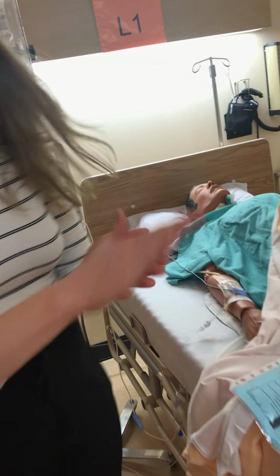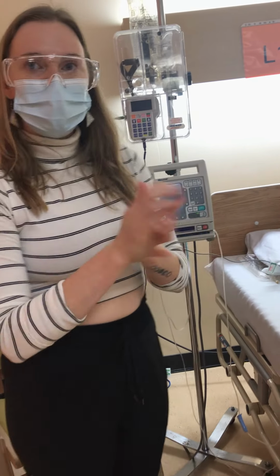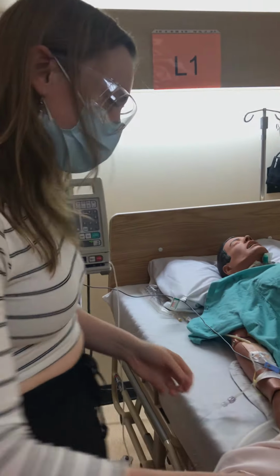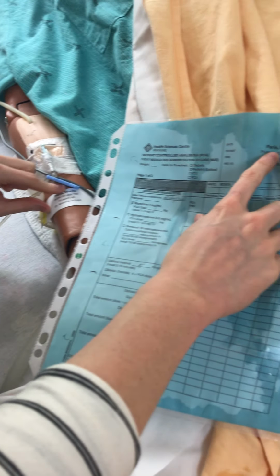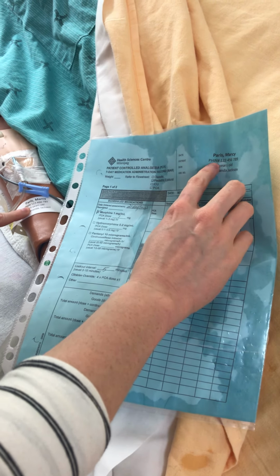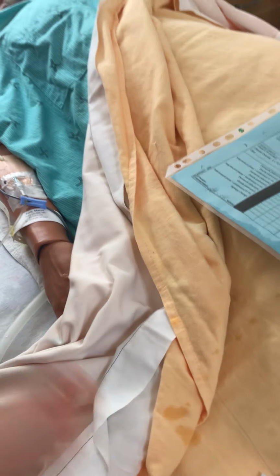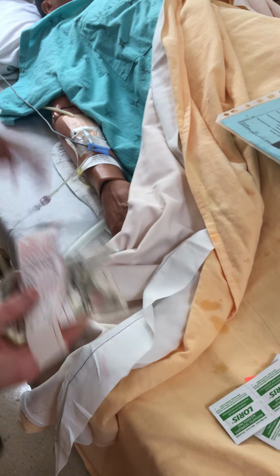So, knocking on the patient's door. Thank you. Hi, my name is Leah O'Hara. I will be your nurse today. I'm going to quickly check who she is. Can you please tell me your first and last name? Marcy Paris. Marcy Paris. Fantastic. And how old are you? 55 years old. Excellent. And I'm checking the fin. 1, 2, 3, 4, 5, 6, 7, 8, 9. I know this is the right patient that I'm looking for. So Marcy, today I'm going to be changing your medication.